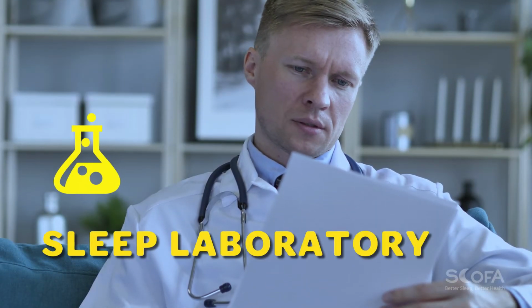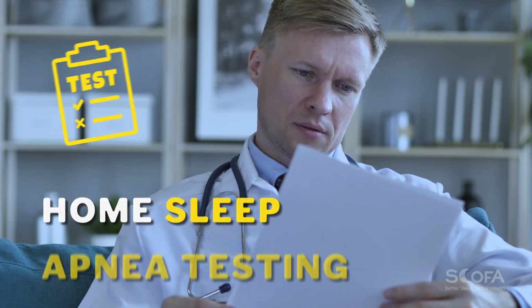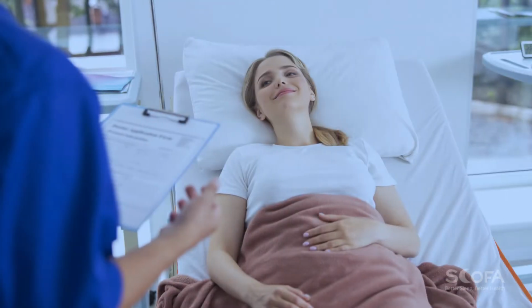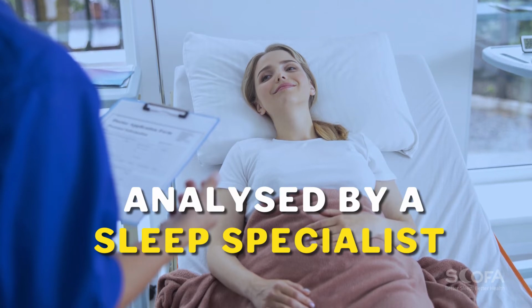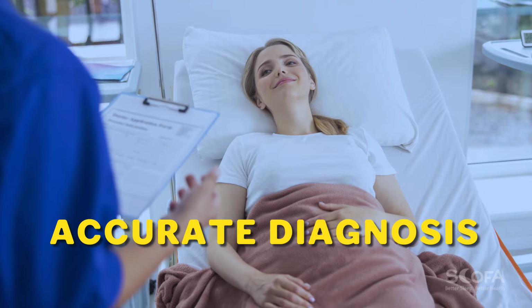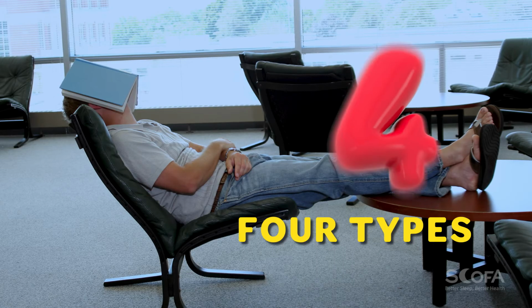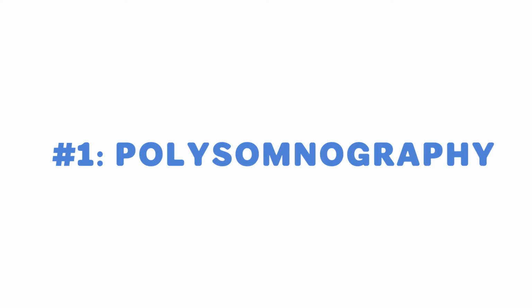A sleep study usually takes place in a sleep laboratory and is conducted by a sleep specialist, except in the case of home sleep apnea testing. Even in that case, the result is analyzed by a sleep specialist, who can even require further testing in the sleep laboratory for accurate diagnosis and treatment. The 4 types of sleep studies that can be recommended are: 1.